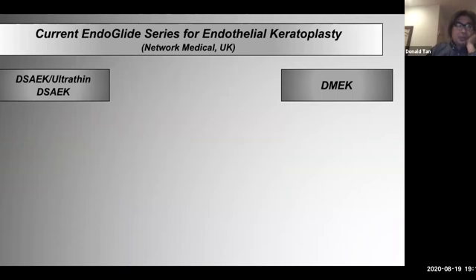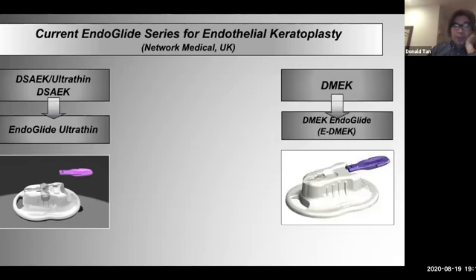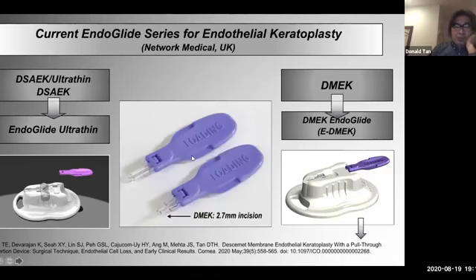It's from Network Medical, the DSEK, which is known as the ultra-thin DSEK model, and a DMEK model. This is the standard ultra-thin that we use for DSEK, which has been around for almost 10 years now. And this is the new model, which has been around for the last couple of years. We call this endoglide DMEK or eDMEK, and published this very recently, the study to show the safety and efficacy. And you see basically the differences on the left here. On the top is the standard cartridge, which is standard width, goes through a 5 mm incision, and the DMEK is much skinnier now because the DMEK roll is much smaller, and it goes through about a 2.6, 2.7 incision.